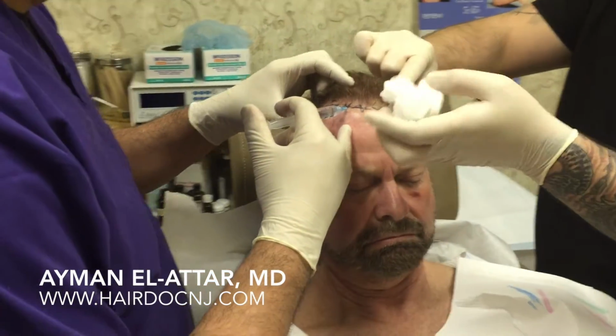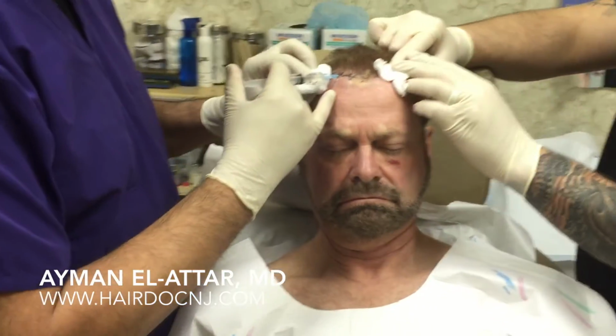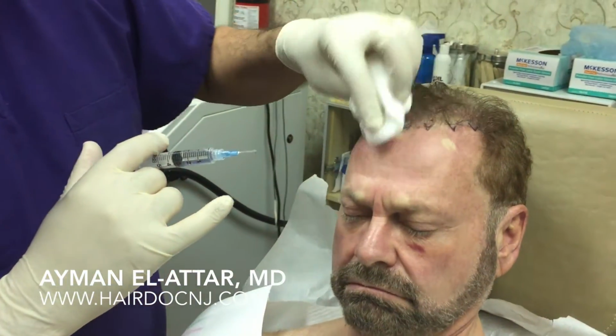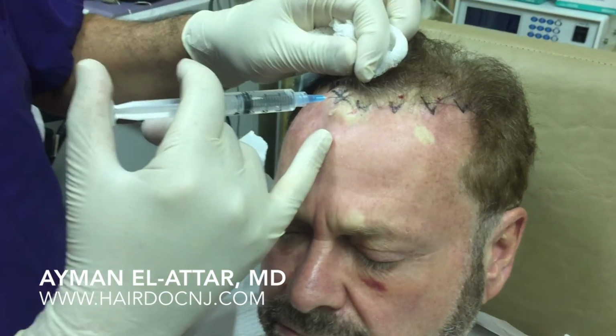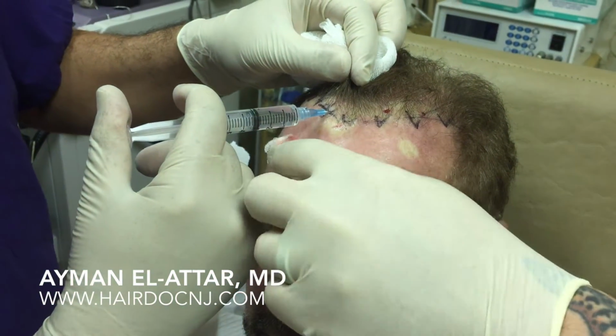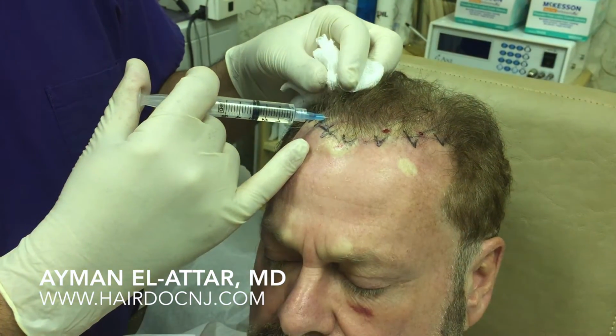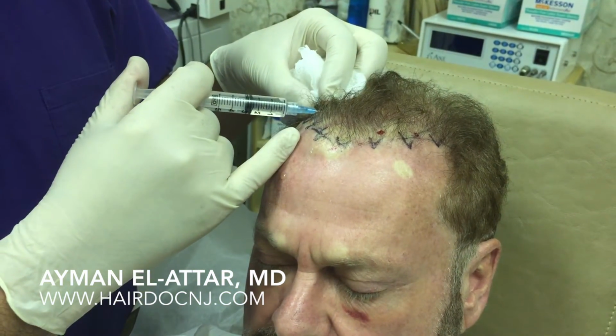Give me photograph, please. Thank you. Do a little bolus. We don't go very deep, just to allow good tumescence of the scalp and easier placement of our grafts.